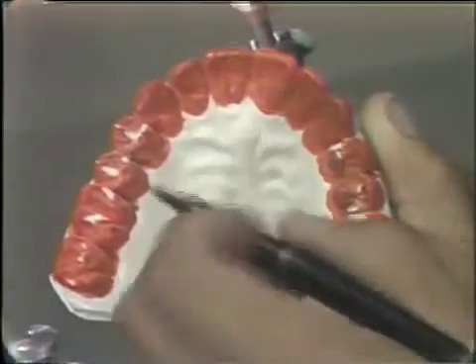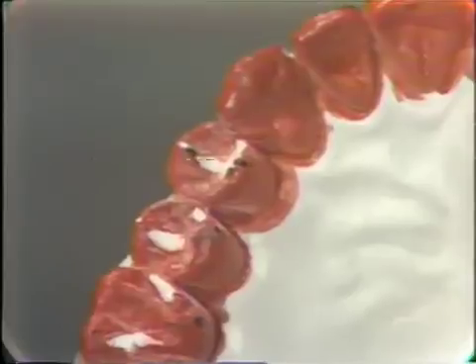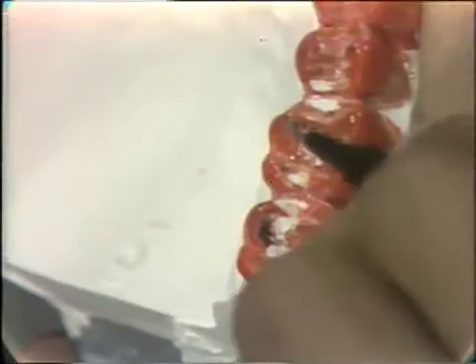Now on this side, the right-hand side with the red ribbon, I notice that there is a contact right here on this tip. This is a working contact, and that's a favorable contact in that it is on the buccal cusp in working. On the opposing side, in the area of the molars, we have a balancing area indicated here and here.